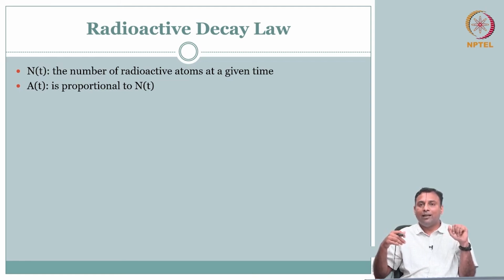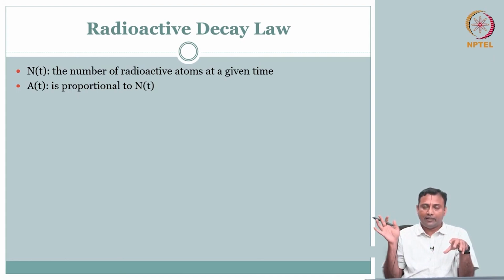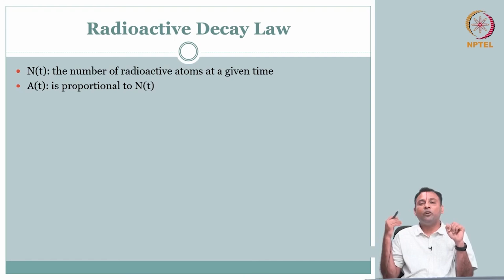Here what is the problem? I am not actually going after the material property of the tissue. All I am interested in is, I have engineered this radioactive material, I have put it in. I want to know, when you put it into the body, where is this radioactivity coming from? It will go through the body, distribute itself, and perhaps go to locations where it is going to be involved, and the radioactivity is going to come from there. So my objective here is to detect where the radioactivity is coming from, and how much is coming from which location.